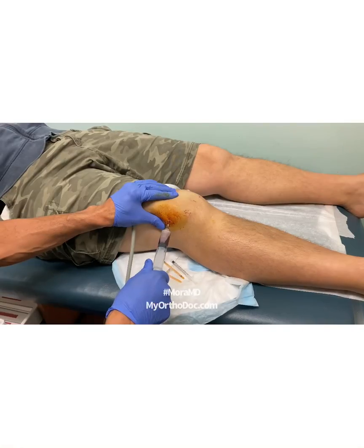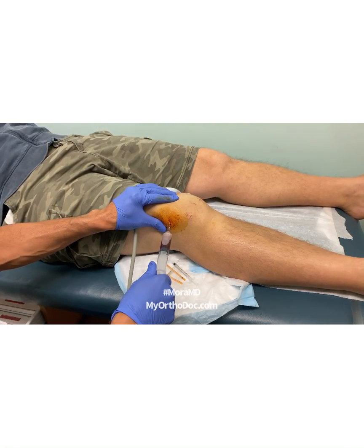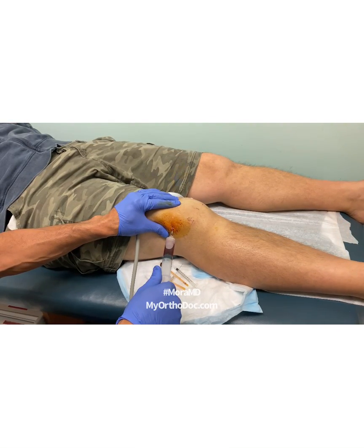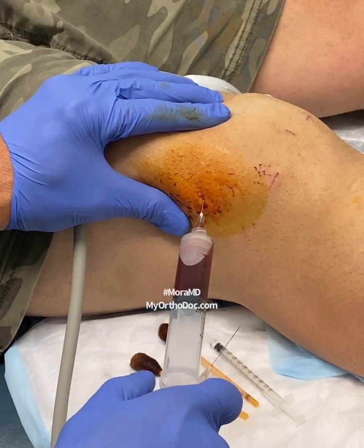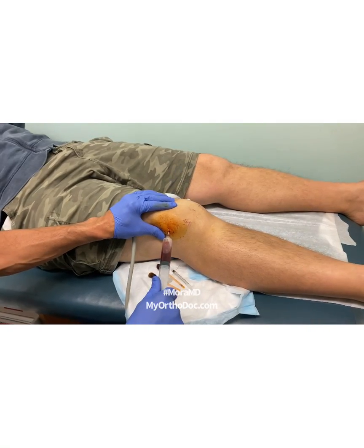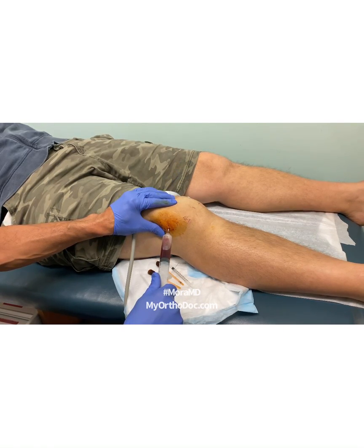Once again, Dr. Moore here — removing a post-surgical hemoarthrosis, or effusion, which is not uncommon following this type of surgery. I do this because I know my patient will feel better tonight and their rehabilitation will move faster. That's what we're doing here — post-surgical care, aspirating the effusion.